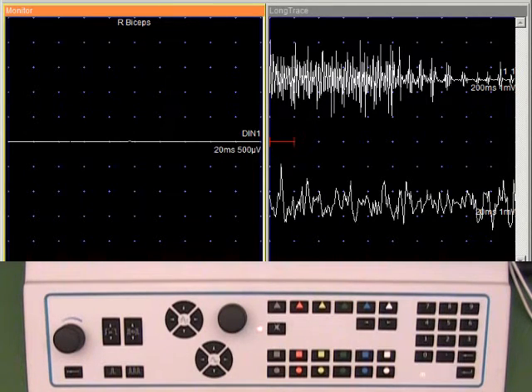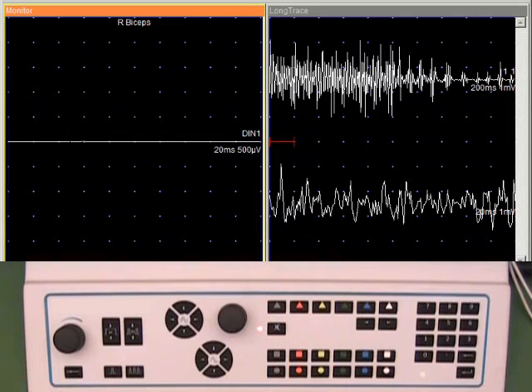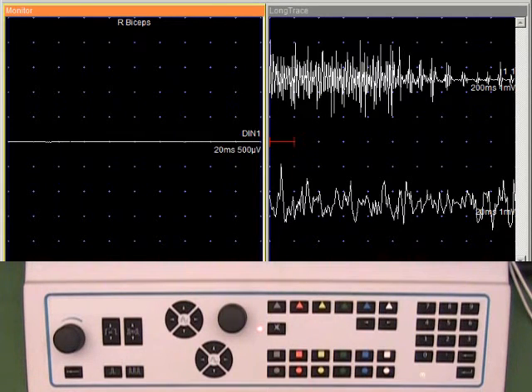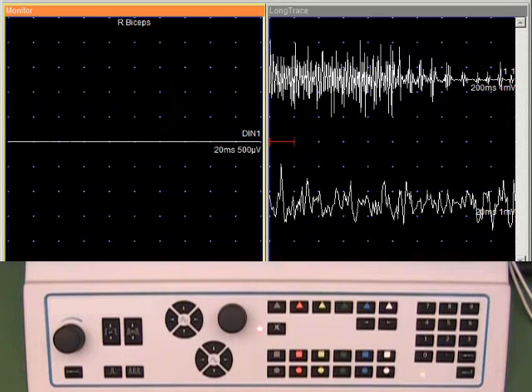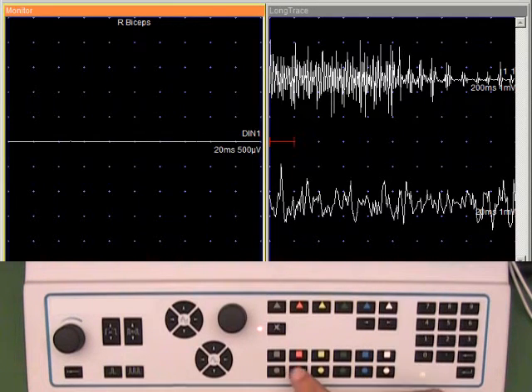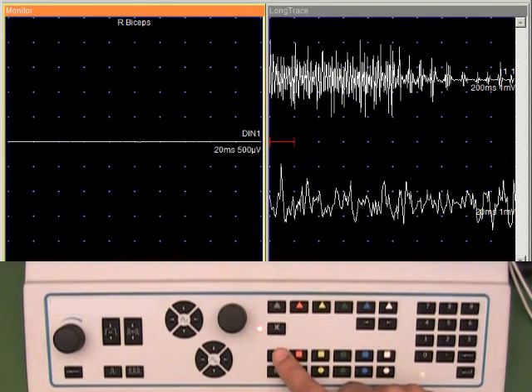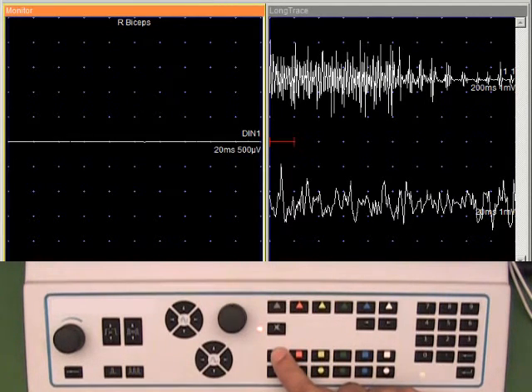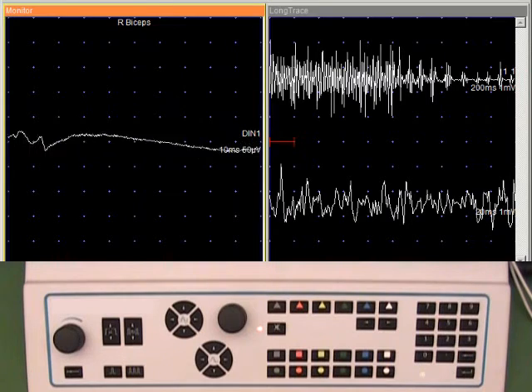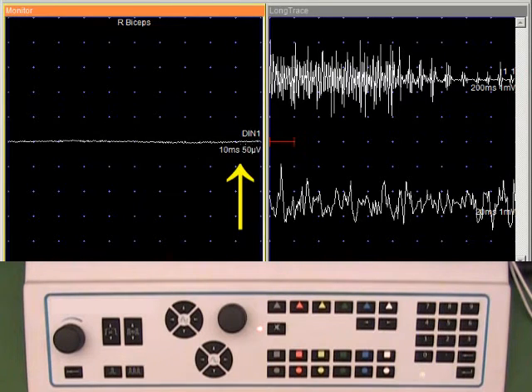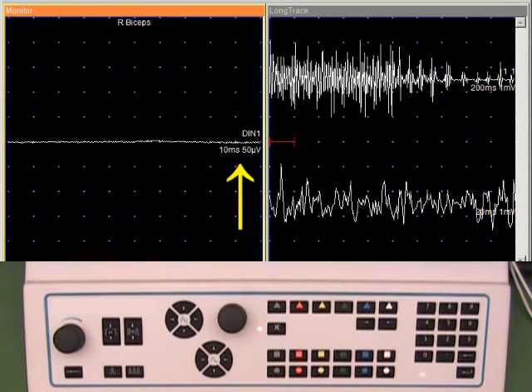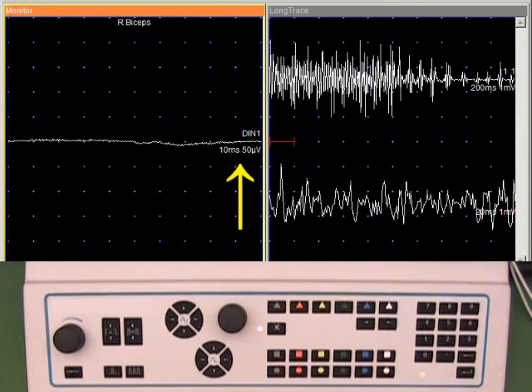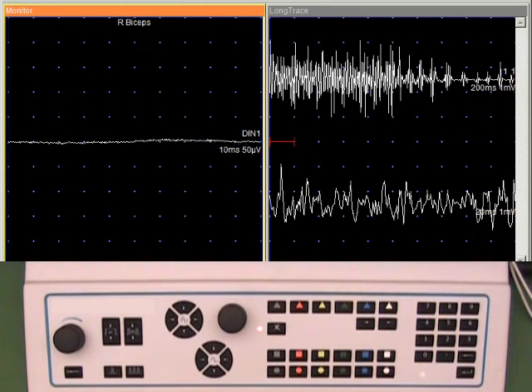Having looked at the recruitment, I can change my needle position to assess spontaneous activity and insertional activity at another site. I will use the EMG staging button to reset my settings to the earlier settings we saw. Now we are back at 50 microvolts per division and 10 milliseconds per division.